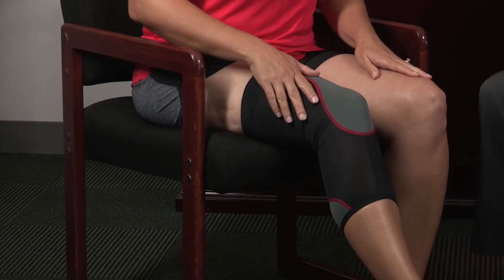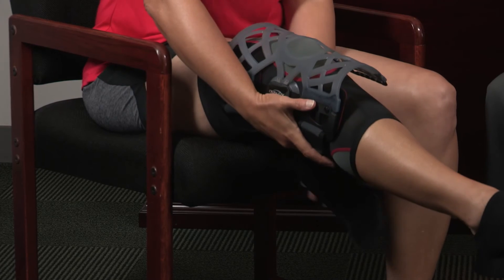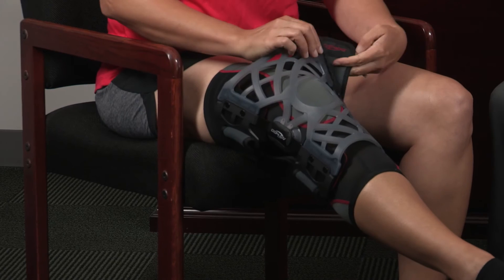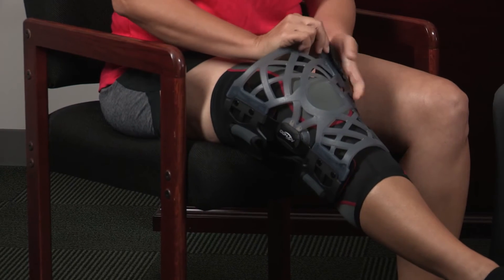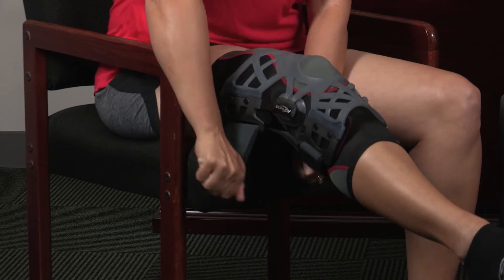We'll apply the brace over. The opening goes right around the kneecap and you're going to bring the straps through on the calf and the thigh. Just at first applying it gently, and then you'll go back and readjust nice and snug.